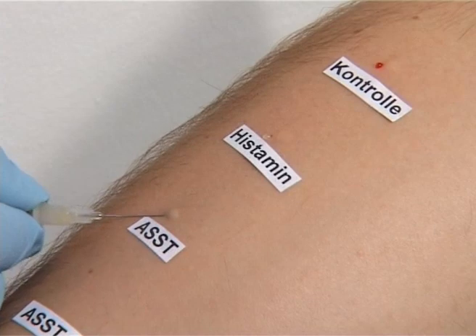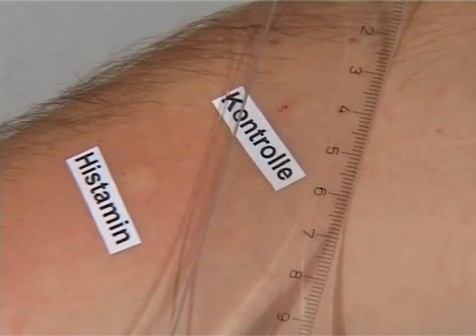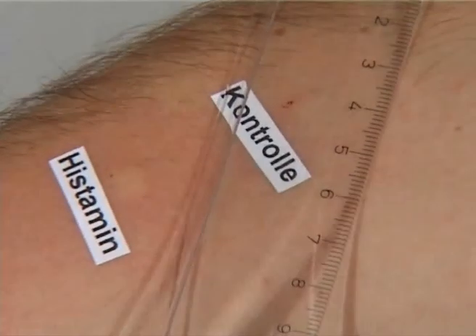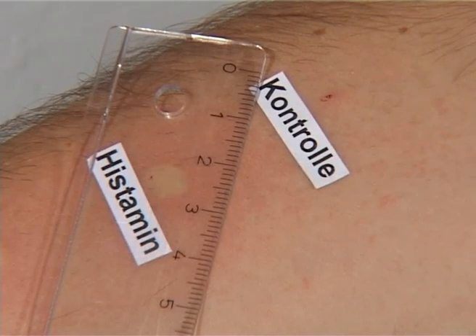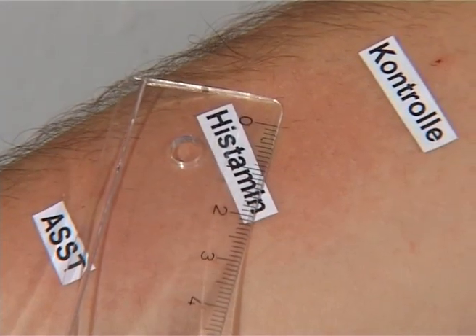The first test reading takes place after 15 minutes. The diameter of the wheel that has developed at the site of injection is measured with a transparent ruler. In this case, there is no reaction. The positive control histamine should be undoubtedly positive. The result is entered into the lab report.